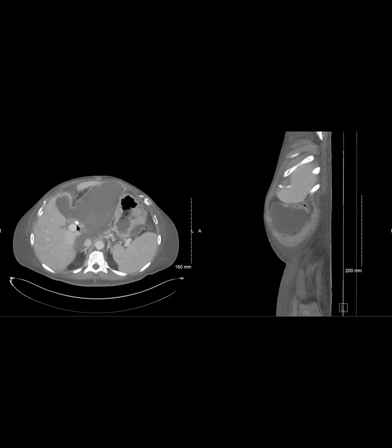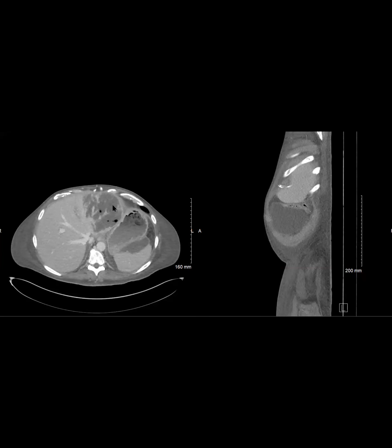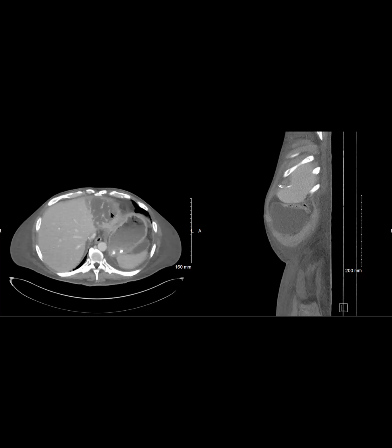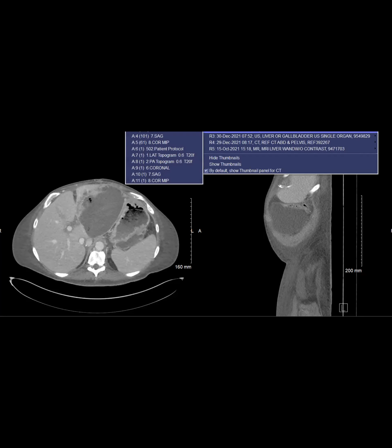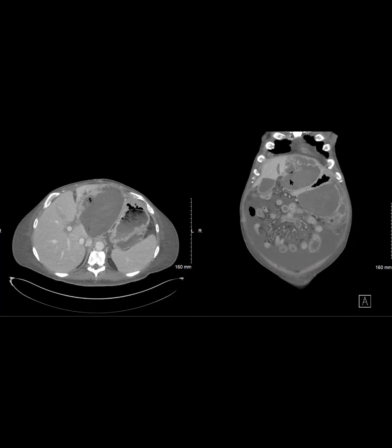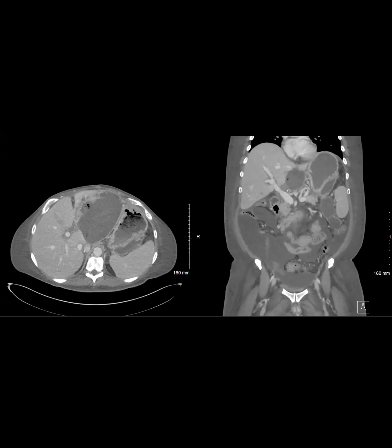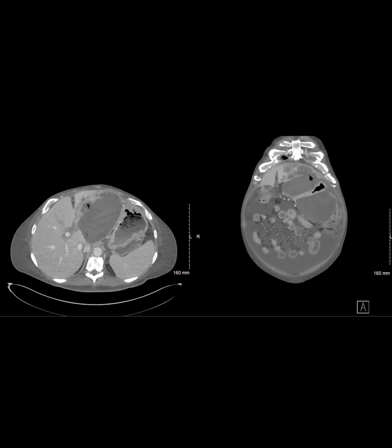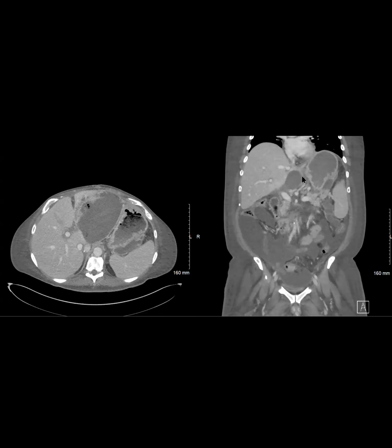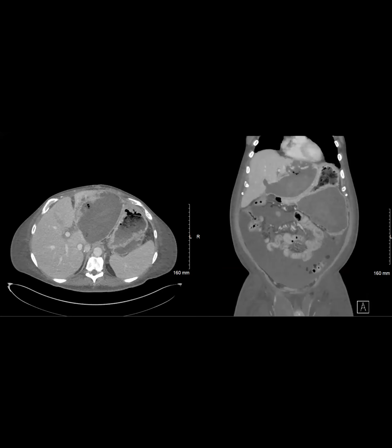And this was an interesting case because this whole thing is just a large hematoma related to the prior rupture. But what's interesting here, which I've never seen, you can see that the left hepatic lobe is completely necrotic, even though the vessels still kind of go through it okay. You can see the discontinuity of the capsule. Here's a coronal. You can see that there's discontinuity of the capsule, so the necrotic liver parenchyma communicates with this perihepatic hematoma, which, to be honest, I've never seen before. So you can see again the areas of capsular discontinuity. This is probably the worst case of liver necrosis I've ever seen.